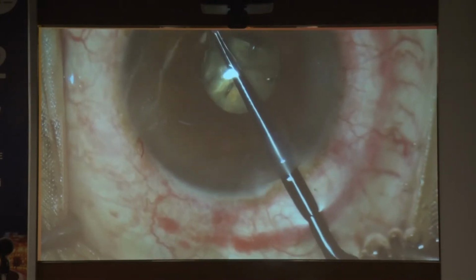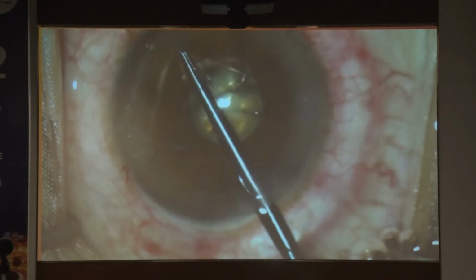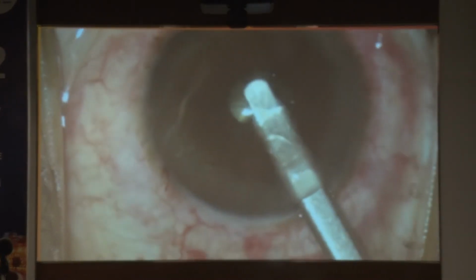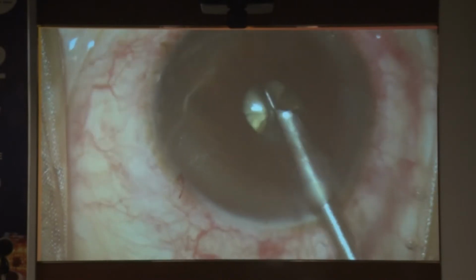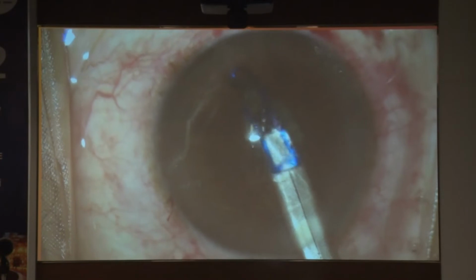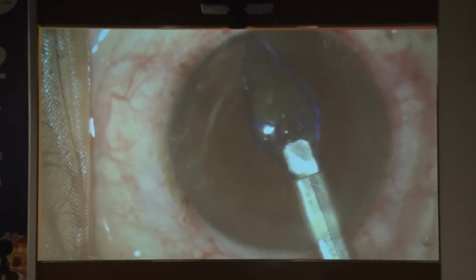You can see me picking it up. It's always better to pick it up because in case there are some bridges over here and you pull, then you'll suddenly have a rhexis running off to the periphery. Again, go bevel downwards, and then of course, when you can see the pupil is so small, you have no option but to put in a ring to enlarge that pupil.